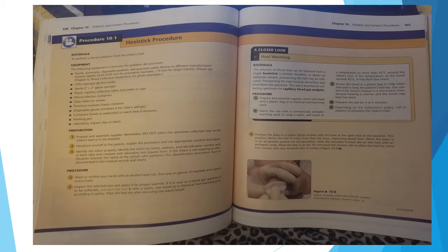Position the baby in a supine or lying position with the knee at the open end of the bassinet. This position allows the foot to hang lower than the torso, improving blood flow. When the baby is in an acceptable position for this procedure, clean the intended incision site. Do not touch the incision site or allow the heel to come in contact with any non-sterile items or surfaces.